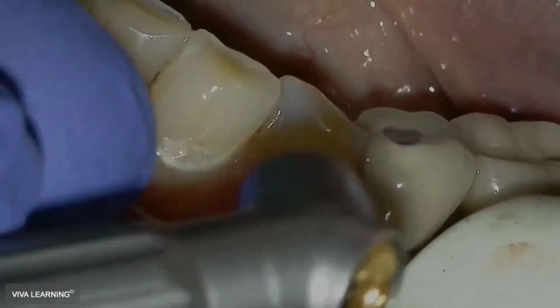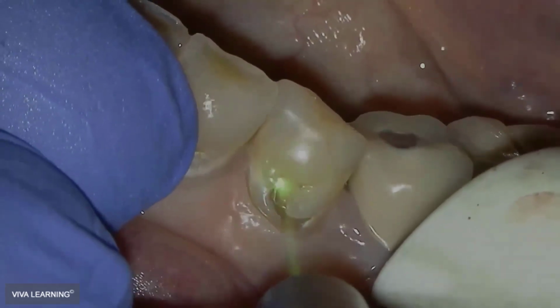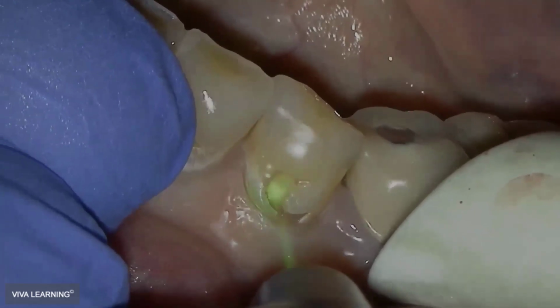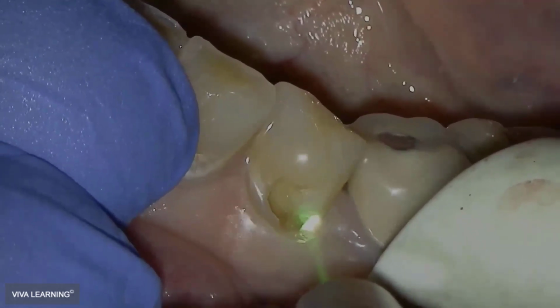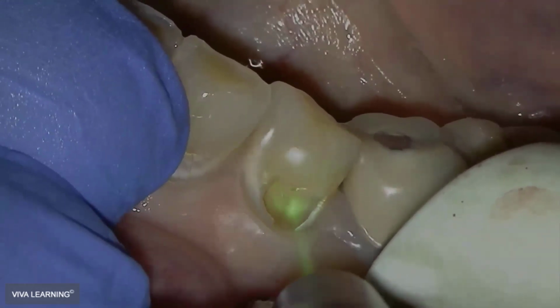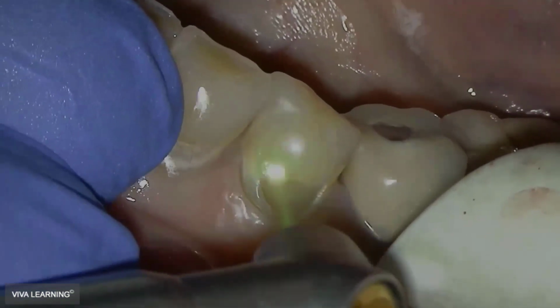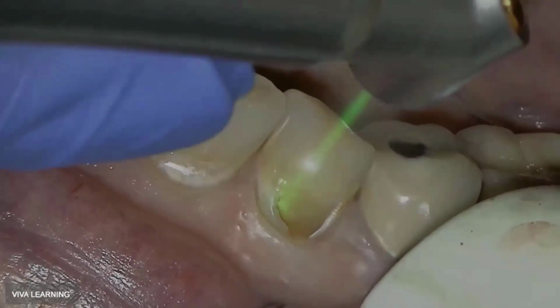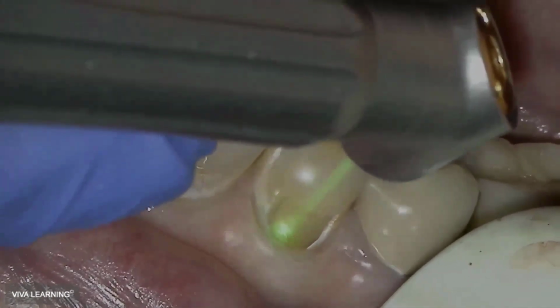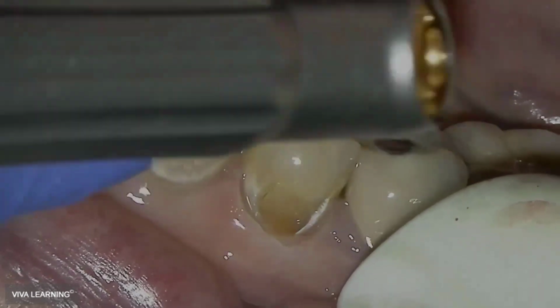But you can see how there's a nice smooth cut there, no bleeding whatsoever. And then we simply turn the laser toward the tooth and start ablating away. And the nice thing with this laser is you don't have to worry about changing the setting. That 9.3 micron beam gets absorbed into hydroxyapatite, decay, soft tissue, composite resin, and can handle ablating that.